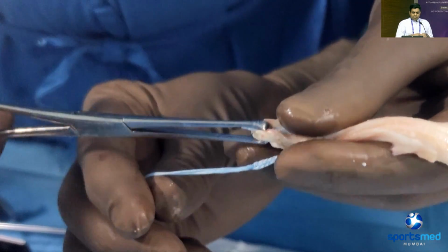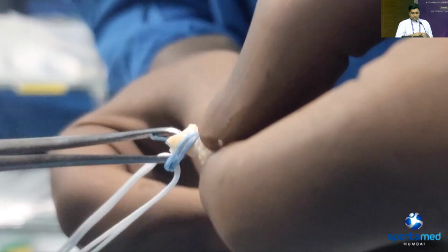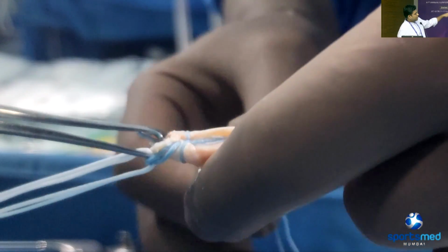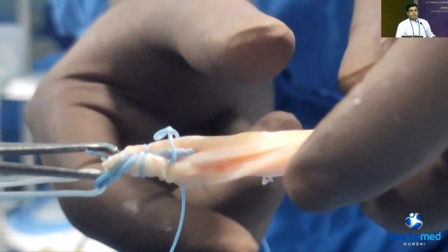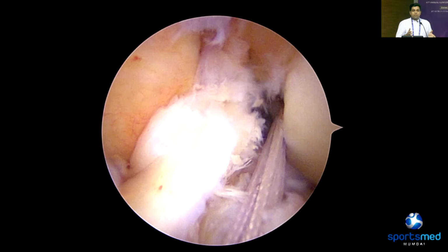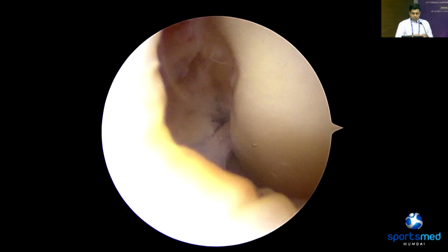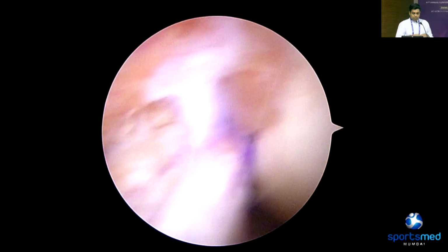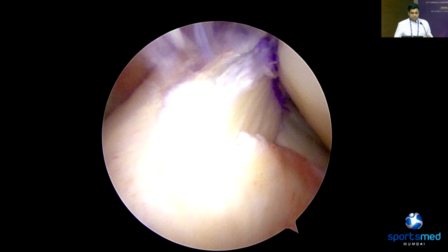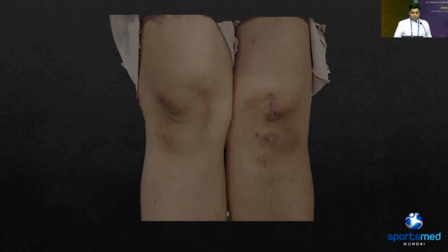Here we are using this implant called the fiber tag, which has a tape at one end and a suture which is put on a straight needle. By passing sutures between the adjustable button and the graft, serially whip stitching one end, we can get a closed construct, and we don't need to insert a screw. We just pass the button, flip the button, and shorten the loop to have a secure femoral fixation for the CQT graft. Here we have used a partial thickness because we didn't want a full thickness, because we do a remnant preserving ACL most often.